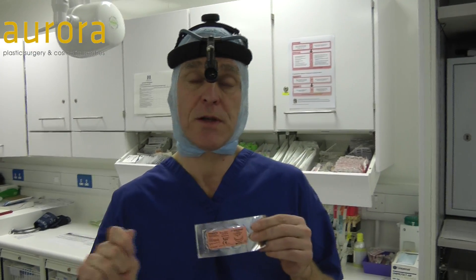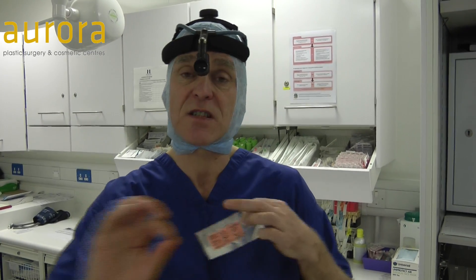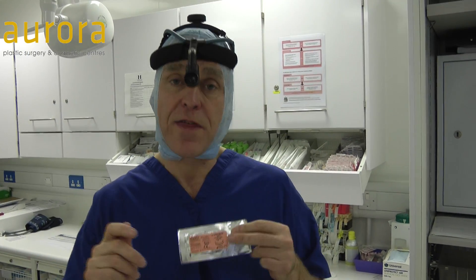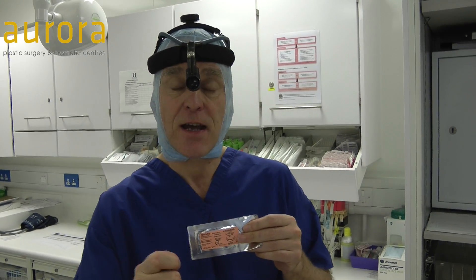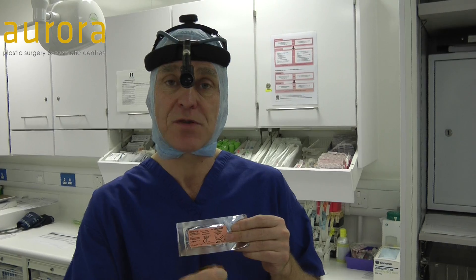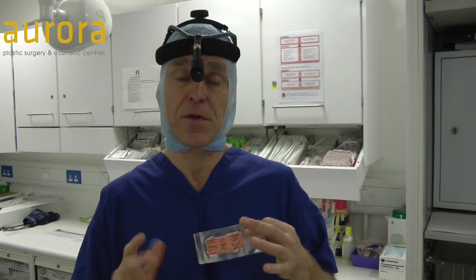Basically, when you normally do a stitch, you pull the stitch through and then the stitch slides either way. With this stitch, there are small barbs in it, so when you stitch, it grips and holds the tissue so it won't slide back.